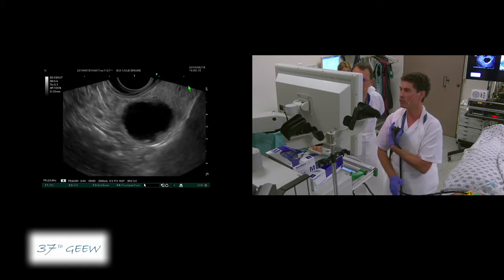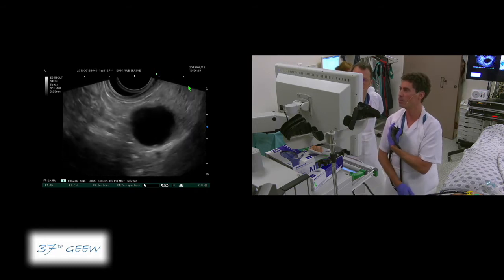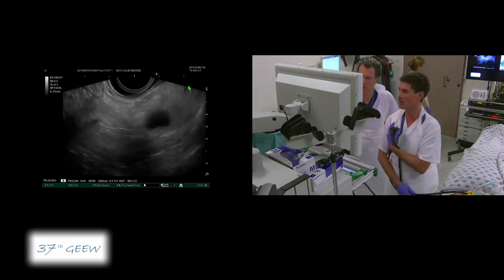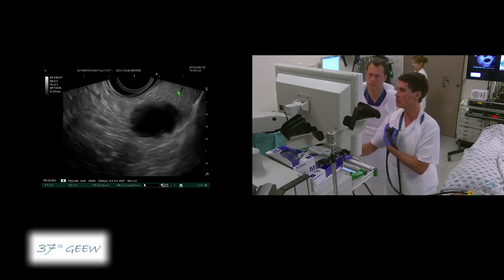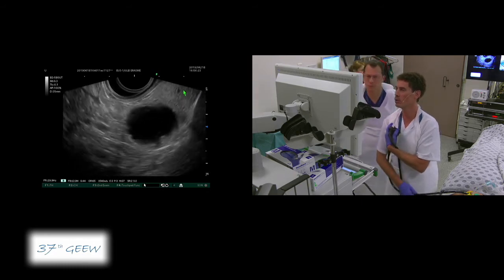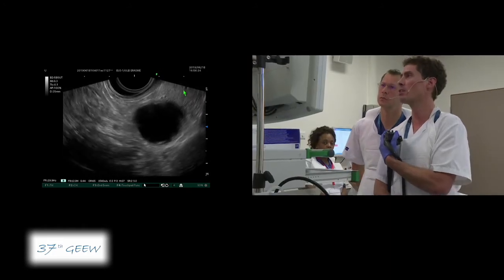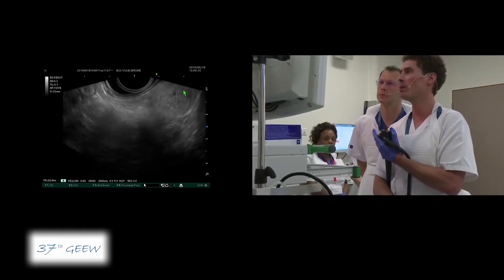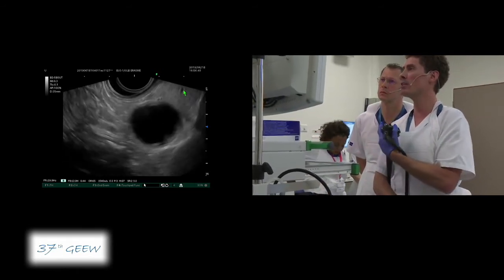And the first thing I do in this case is try to see where the pancreatic duct is with this thing. And you see, we see very well the pancreatic duct there, and we will try to see if there is any communication between this ductal system and the lesion. So I turn clockwise. I see that the PD is coming up very far, and I see nothing communicating.